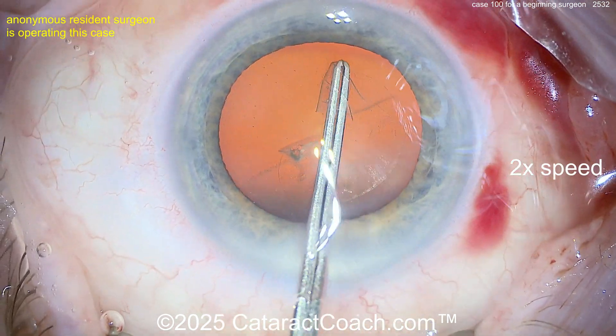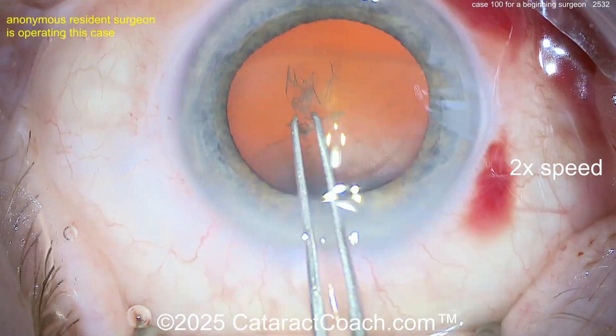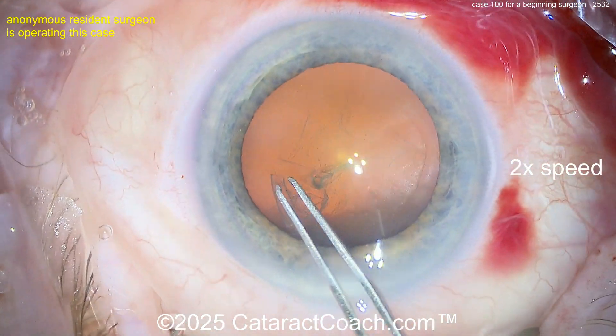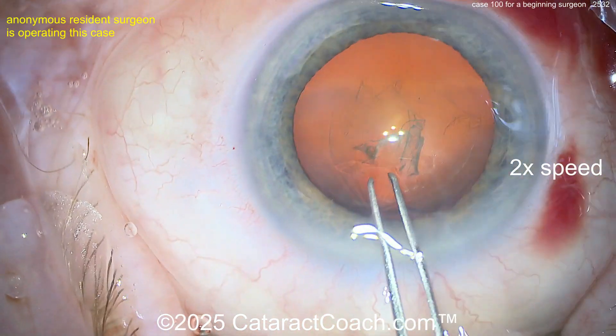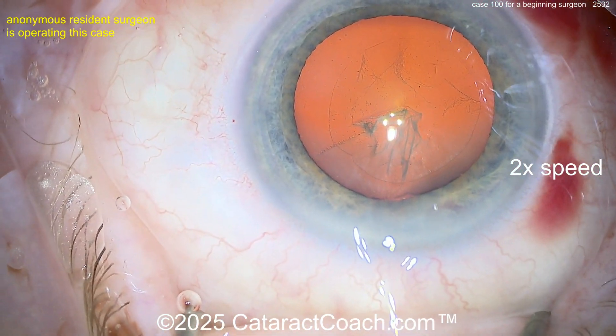There's a video called 'rhexis danger zones' and you need to look that one up. Now continuing the rhexis — I like this. I don't mind mini-grabs; as you know, I had a video recently showing that I'll do a rhexis sometimes with multiple grabs. Whatever it takes — I want the end result to be beautiful. And this looks actually like a pretty good-looking rhexis. For case 100, the rhexis is a good job.